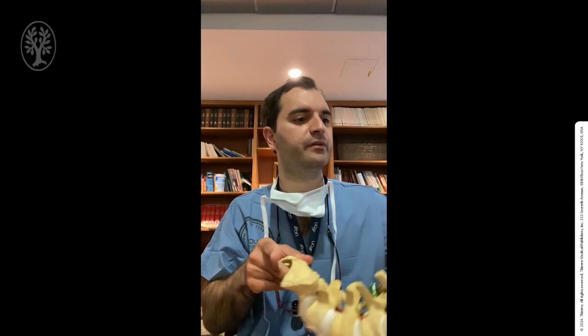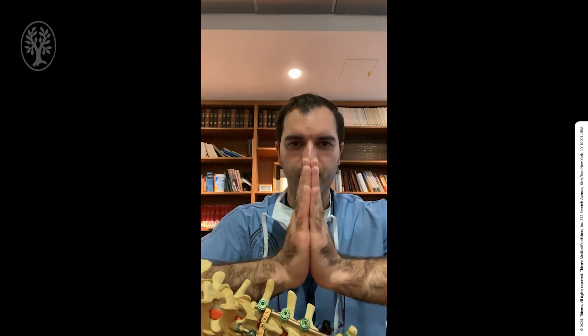Now that we understand the components that make up our implants, we can understand the component-component interfaces. Dr. Benzel does an excellent job of illustrating 7 commonly employed techniques of holding a longitudinal connector against an anchor. Essentially, all of these techniques employ the force of friction to do their job. The force of friction equals the coefficient of friction times the normal force acting against the two objects in contact with each other. For example, if I take my palms and place them against each other, the force of friction equals the normal force, where I'm pushing my palms together, as well as the material properties between my two palms.